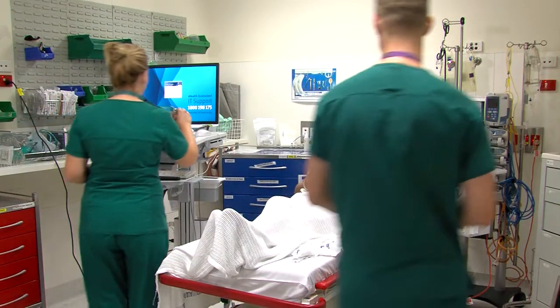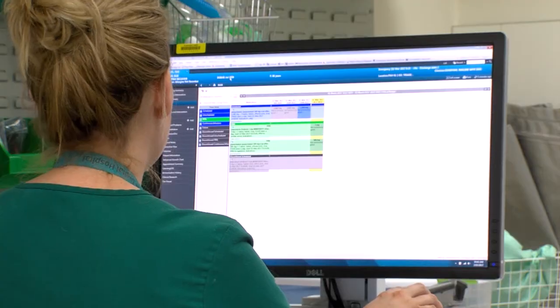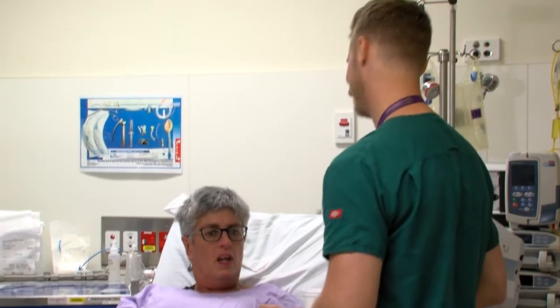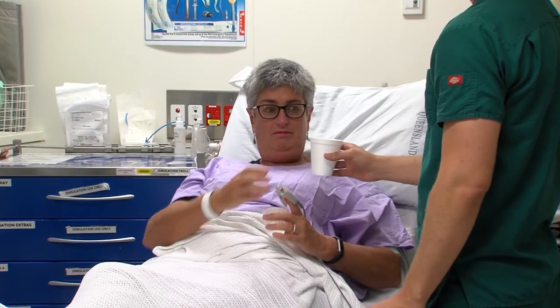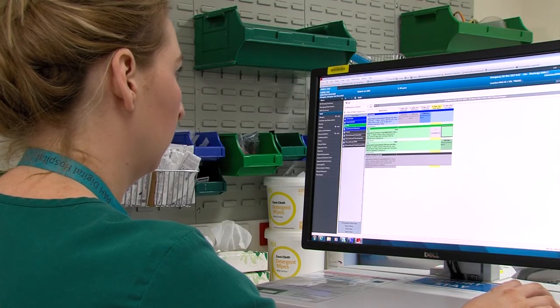Once the nurses have returned to the patient's bedside, they will open the correct patient's MAR. The nurses will perform the rights of medication administration. The primary nurse completes the medication administration task in the MAR. Before leaving the room, the nurse taps off the computer.